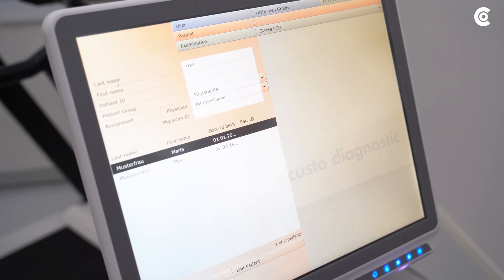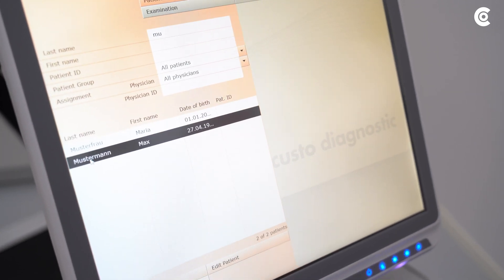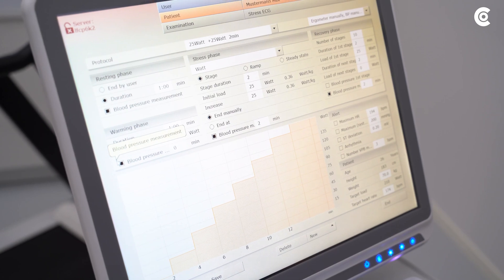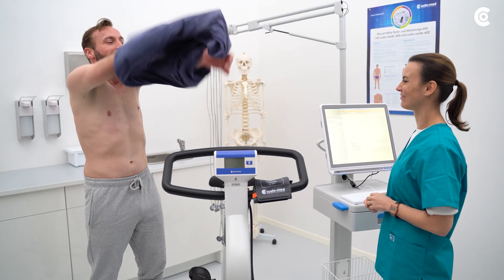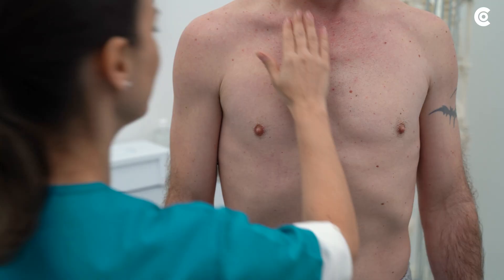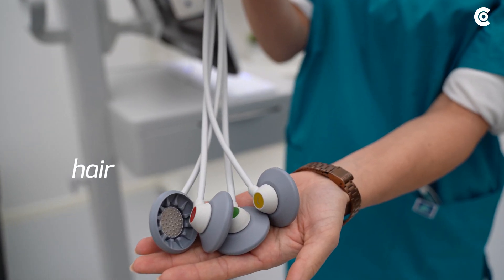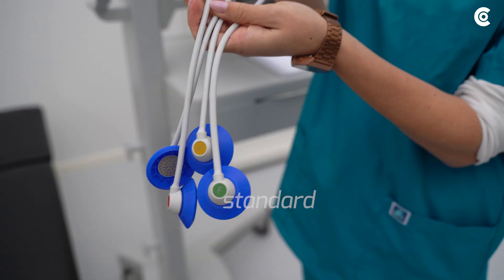First, create the patient data in Custo Diagnostic or use the already existing data. Then prepare the patient for the measurement. Make sure that there are no residues on the spots where the electrodes will be placed. Furthermore, select the electrode type that matches the patient. Three different types of electrodes are available.